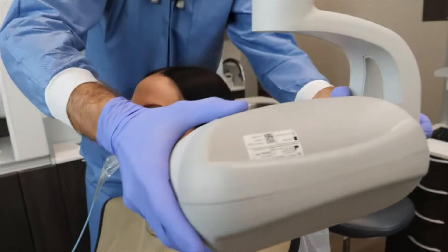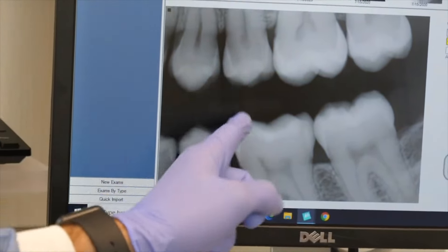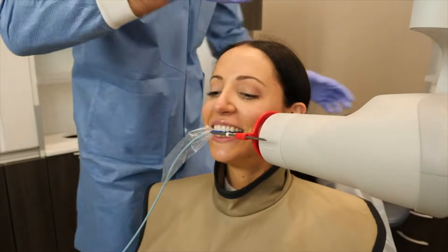So technically the cavity is not really hidden. You can see it with an x-ray. That's why we have x-rays. And now let's see what it looks like once you open it up.